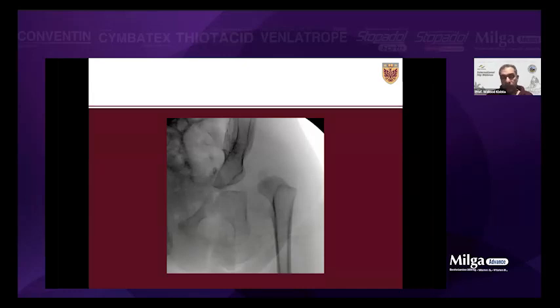Use two hands on the Cobb so things will not slip posteriorly, and all the vital structures are in the sciatic notch. Same thing on the outer table. Subperiosteal, control the bleeding. Keep backing this with sponges. I use 4x8 sponges, and make sure you count them with the nurses for the final count at the end.